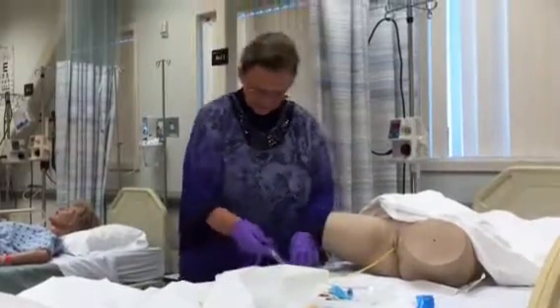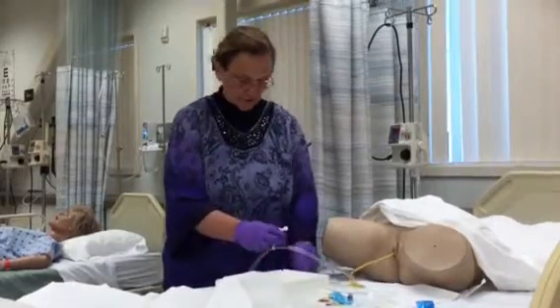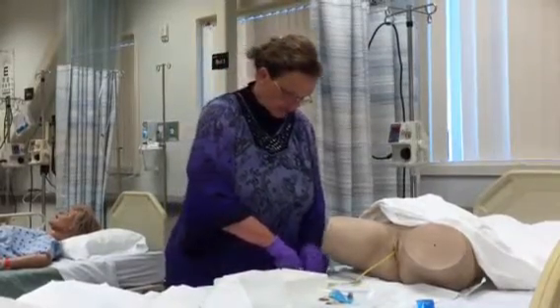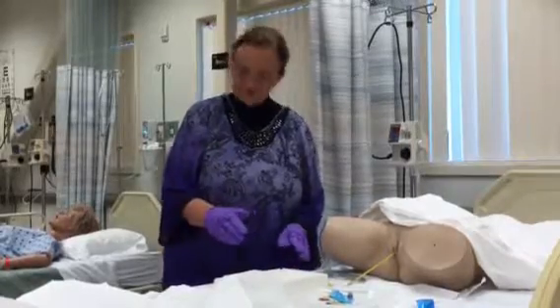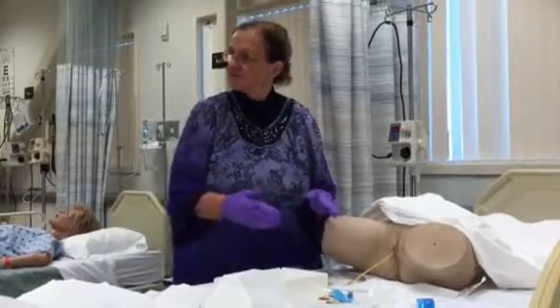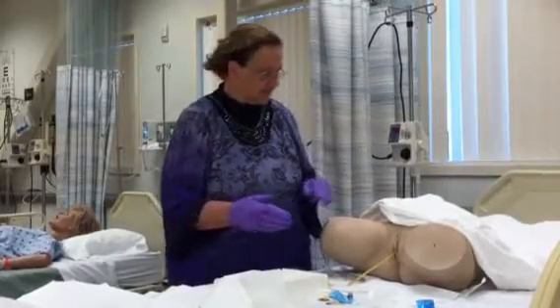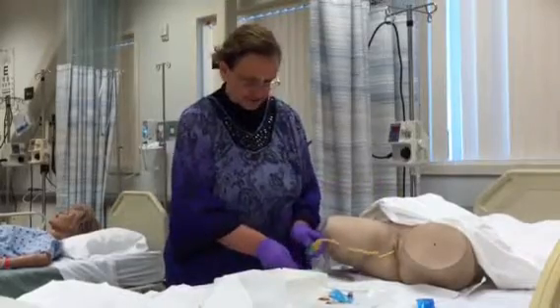And then they also have this rubber band with a little clip, so that I can clip it on the patient's sheet so that the catheter isn't pulling on the urethra. And then afterwards I just might get a washcloth and clean it off a little bit, all right? And then basically my procedure's done.